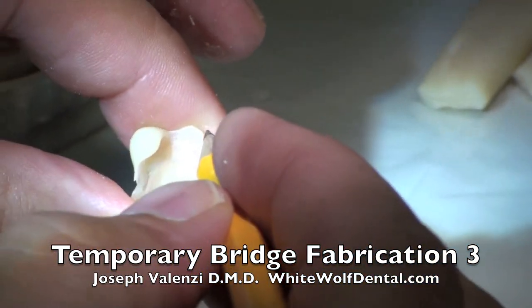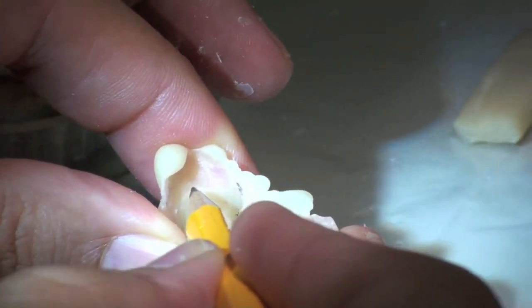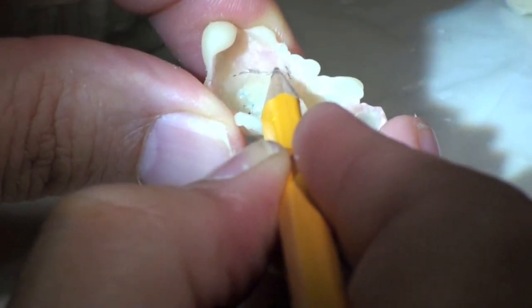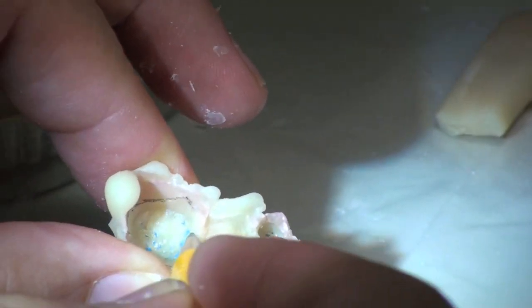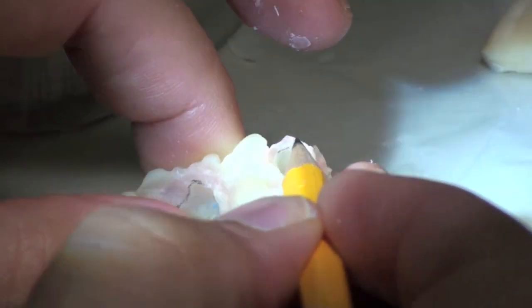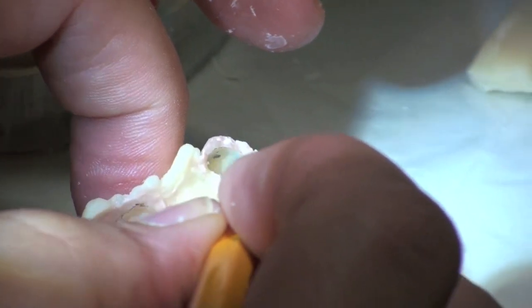Now, a helpful thing to do at this point is to trace where the margins are. Oftentimes if your line is nice and accurate, you'll be able to see those margins very clearly. Just take a pencil and mark where they are, and that becomes your inviolate line — a place you cannot, you don't want to ever touch.